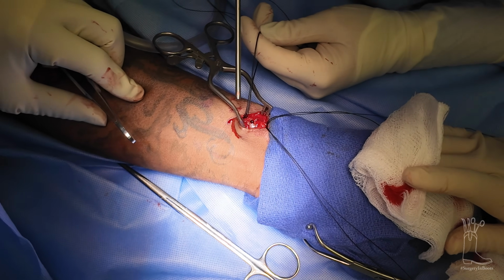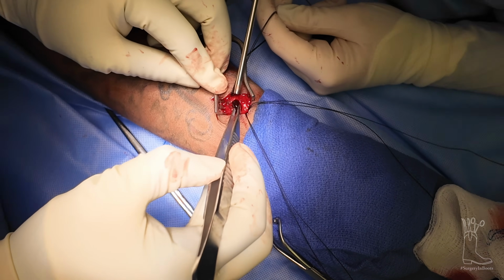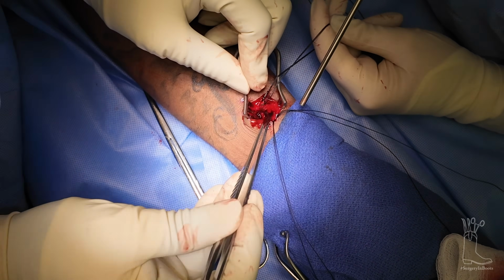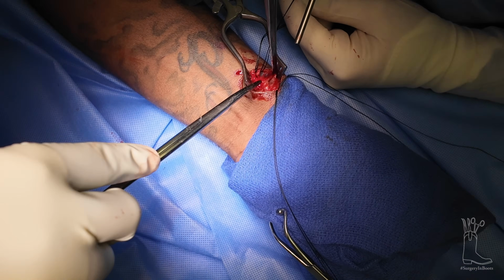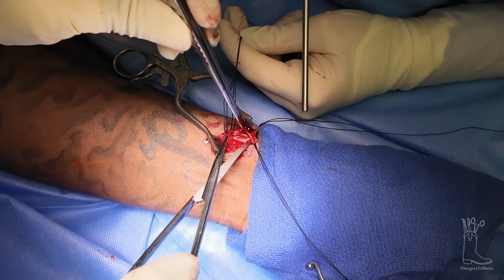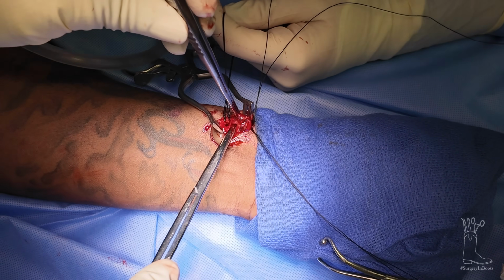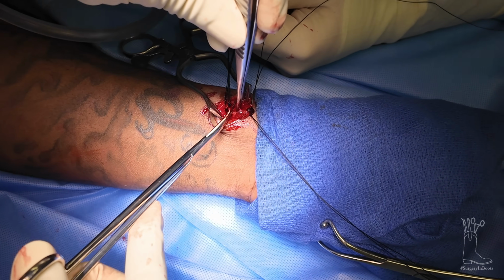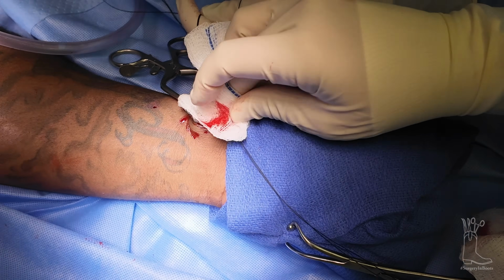There we go. So old clot's coming out. So that's all old hematoma, which is good, which means we're not bleeding, which means now we did everything that we were supposed to. So now we actually can get into it pretty rough. What it also tells me is that I have ligated what I needed to ligate, and instead of cutting it right there, I'll cut it on that side, dissect it off. Hemostat, please. Actually, I can use this.